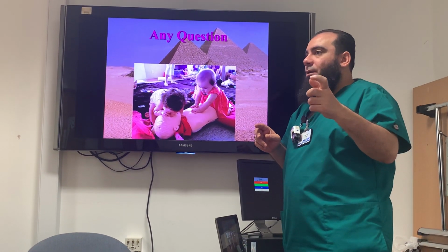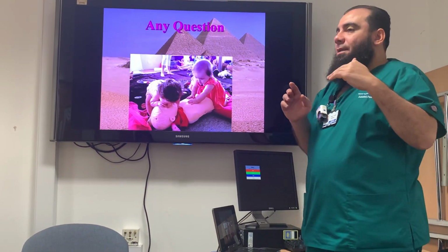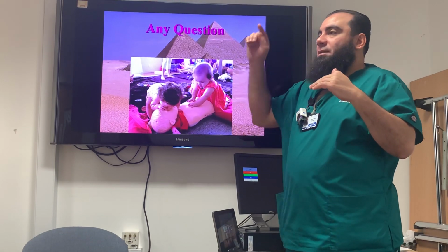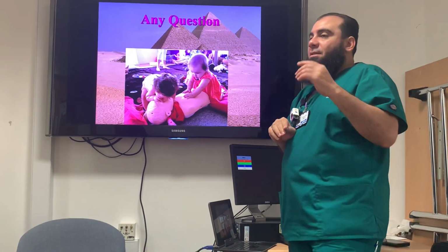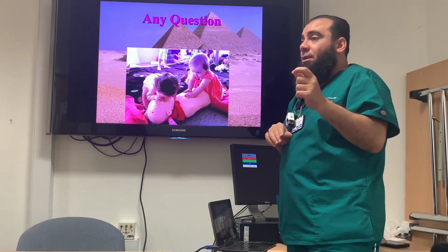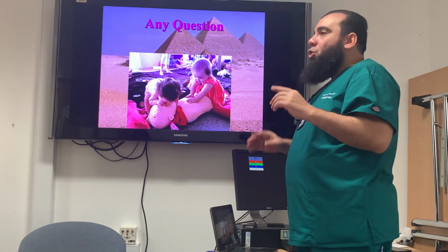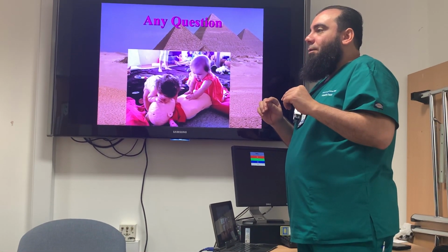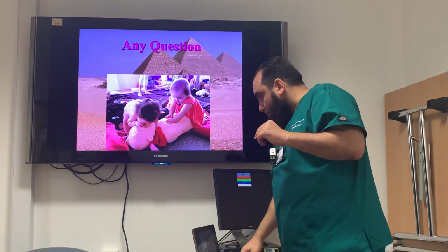So we can ask about the peak time. Check the peak time between the end of the PR interval and the peak of the R wave. If it is more than 50 milliseconds, we consider hypertrophy. If not, it's fine. It's also good in VTAC and SVT separation. So any questions? It's okay. Okay. The next one.